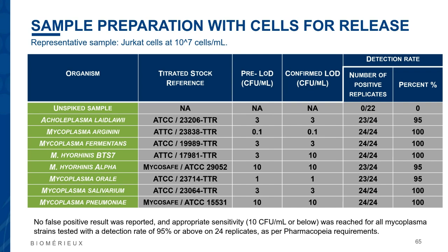As you can see, all the mycoplasma were at the percentage that is expected. And most interestingly, no false positive results were observed, okay?